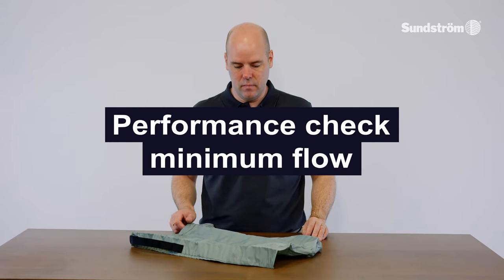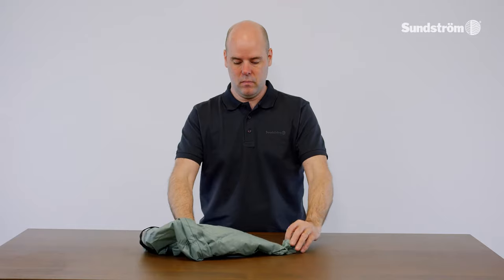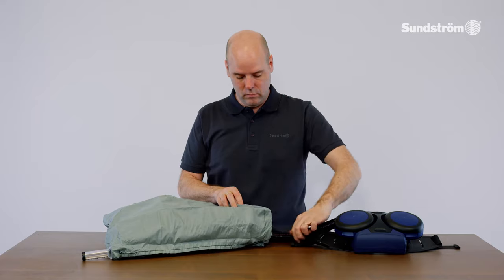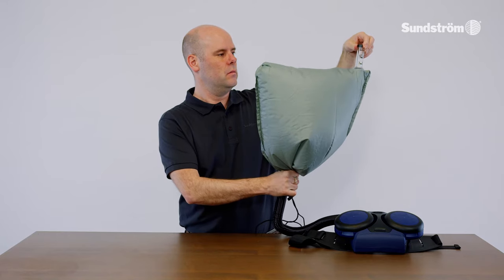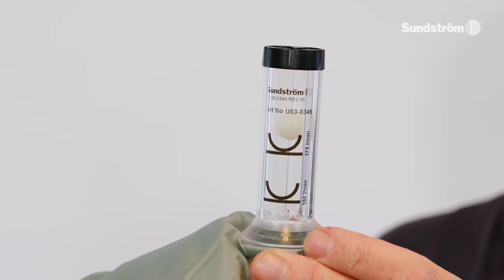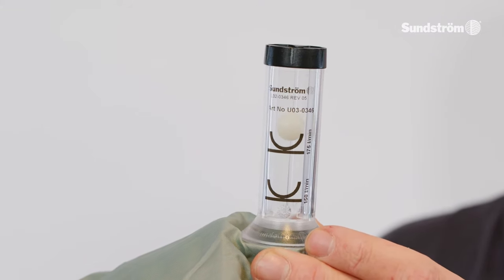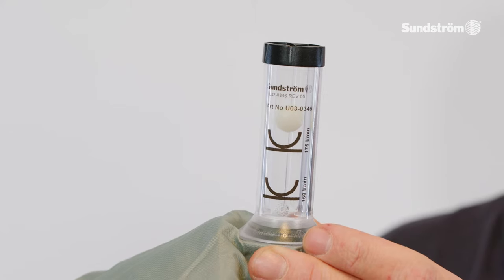Performance check — minimum flow. Turn the flow meter bag inside out so that the transparent measuring tube is on the outside. Place the head top in the flow meter bag. Connect the hose from the head top to the fan unit and turn it clockwise about 1/8 of a turn. Start the fan unit. Grip the lower part of the bag to seal around the hose. Grip around the measuring tube and hold the tube vertical. The ball should hover in level with or just over the 175 liters per minute marking. If the minimum flow is not achieved, check that the flow meter is vertical, the ball moves freely, and the bag seals well around the hose.